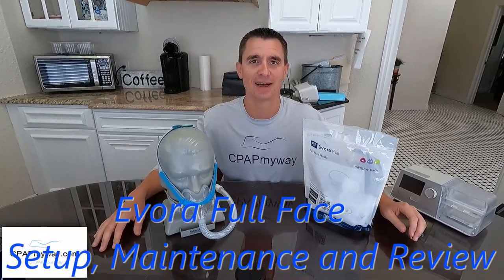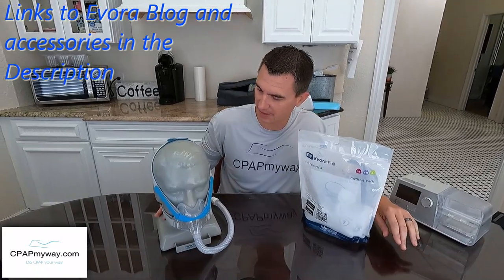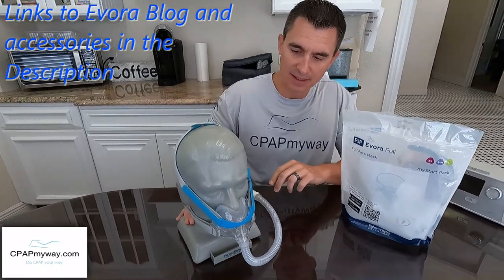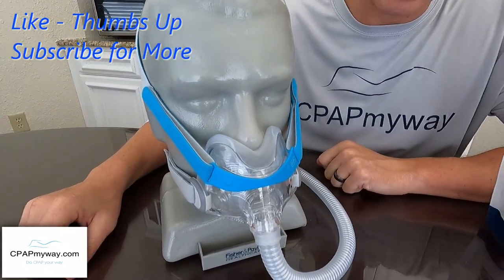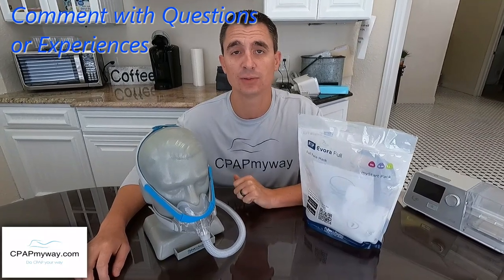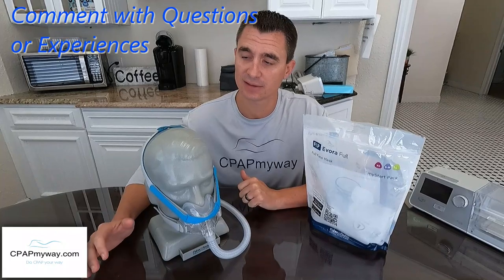Hey, it's Clay, CPAPMyWay, CPAPMyWay.com. Today we are here to discuss the new arrival, the Evora Full Face from Fisher & Paykel. I'm a big fan of these minimal contact full faces — that's what I call them. And finally, Fisher & Paykel is in the game. Fisher & Paykel does make a really good mask, typically. We really love the Viterra, the Bravita, the Evora Nasal, the Eson II — all of them are really good quality masks, and I don't think this one's gonna disappoint.